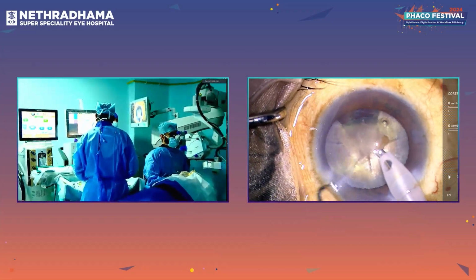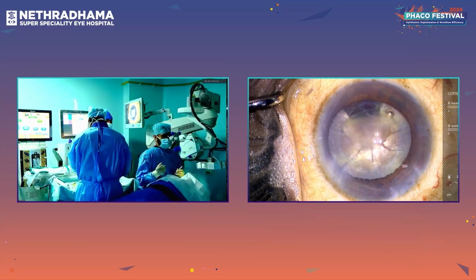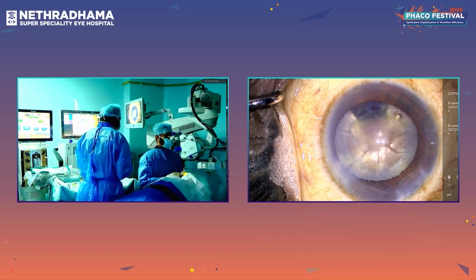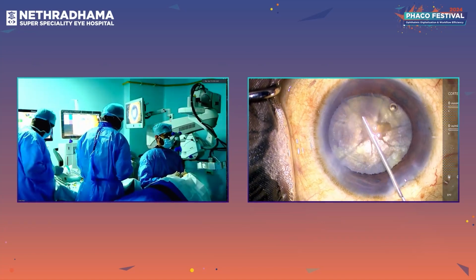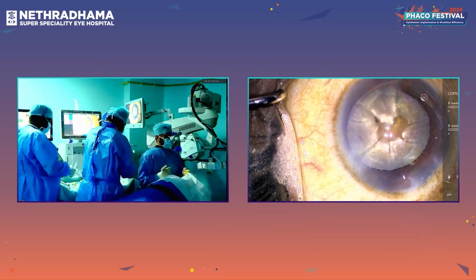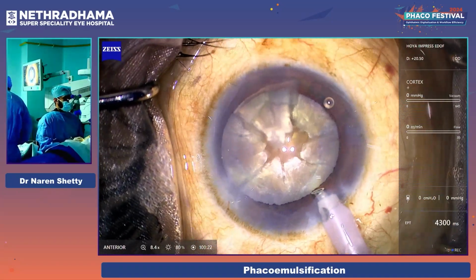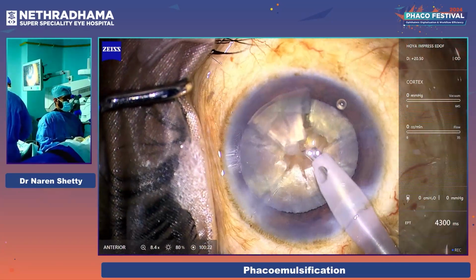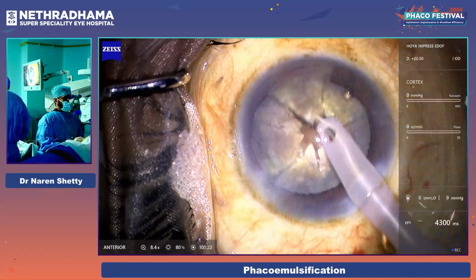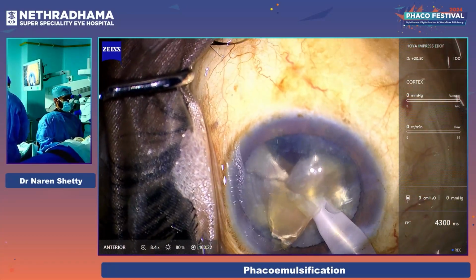So I finished chopping all my pieces. Ocucoat, please. Any kind of viscoelastic, once you finish your chopping, just fill the chamber. Phaco, please. So what I normally do is I take out my second handpiece and start doing the phaco in one hand itself.